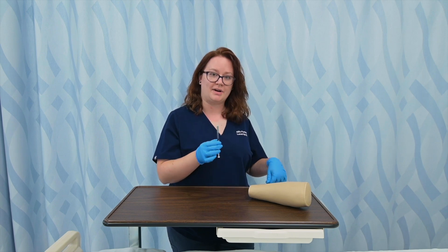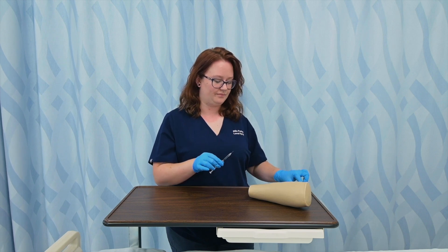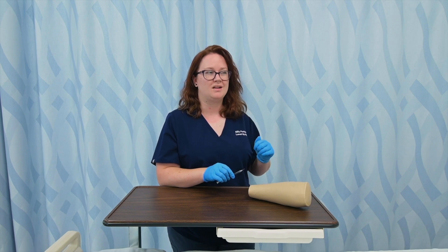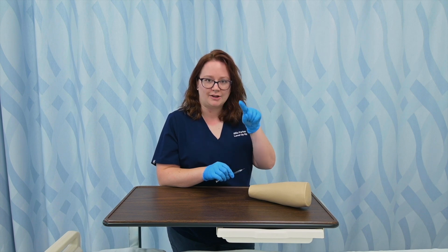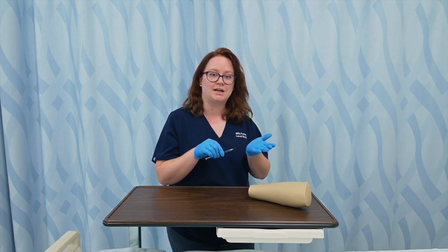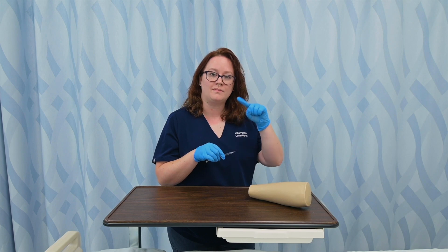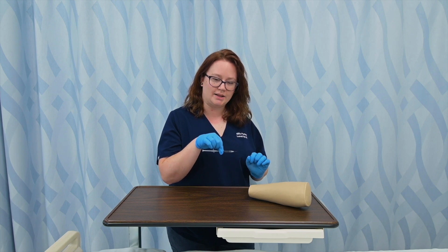I'm always going to use a very small gauge needle. I'm going to position it so that the bevel is up. I want the bevel up because for intradermal injections, I want the bleb to form — which can also be called a wheal or a bubble — like when you get that TB shot and you get that little bubble that forms. If the bevel is down and I inject the medication down, it won't form the bleb that I'm looking for.